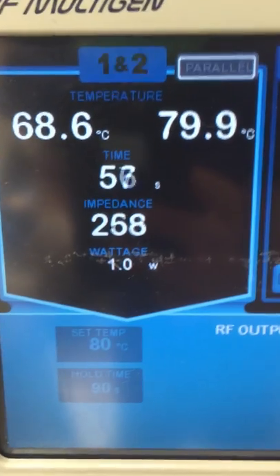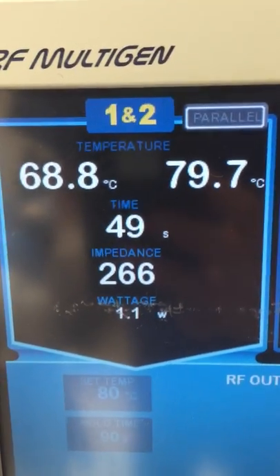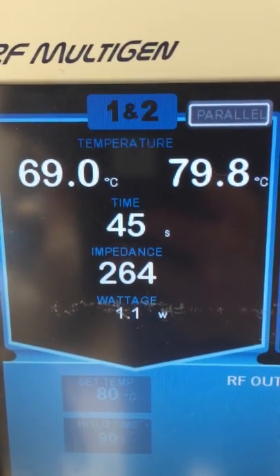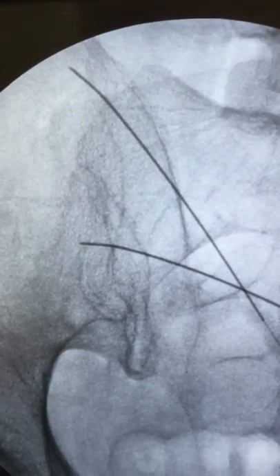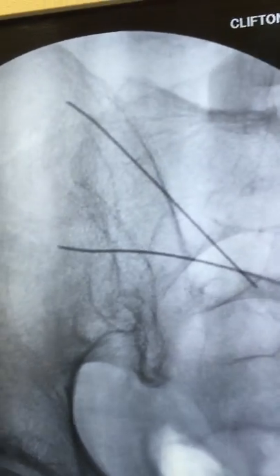This shows the needles in the superior two-thirds aspect of the joint, the ablation having taken place between the S1 and S3 nerve roots.